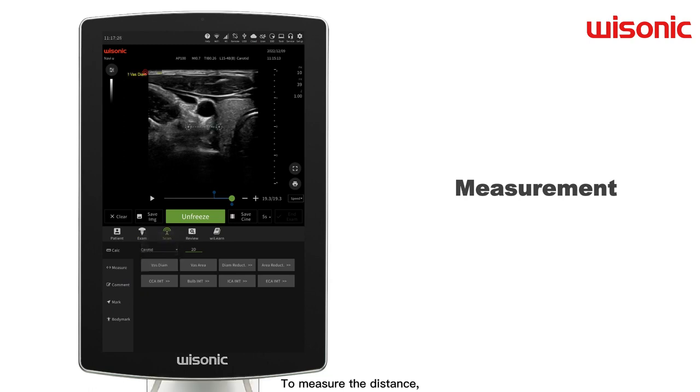To measure the distance, there is a highlighted green dotted line on the screen, with two empty rings on the two endpoints of the line. Drag the point to your desired position. To complete the measurement, exit measurement mode or start another measurement.